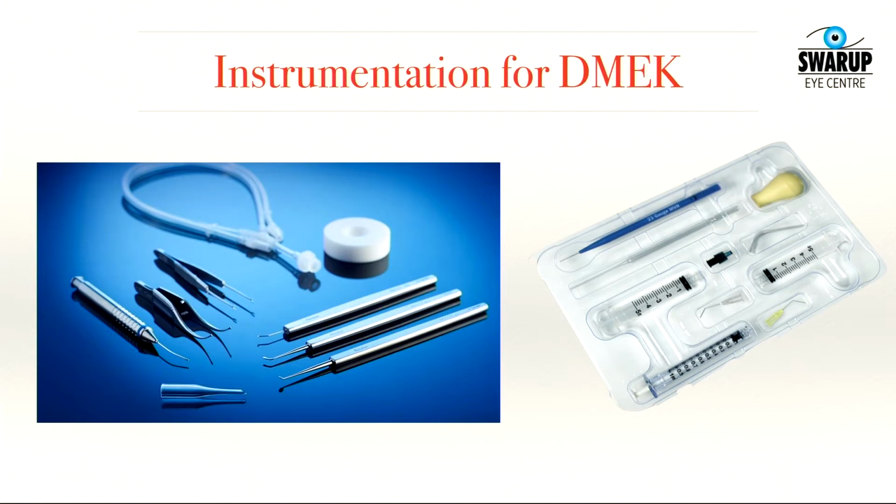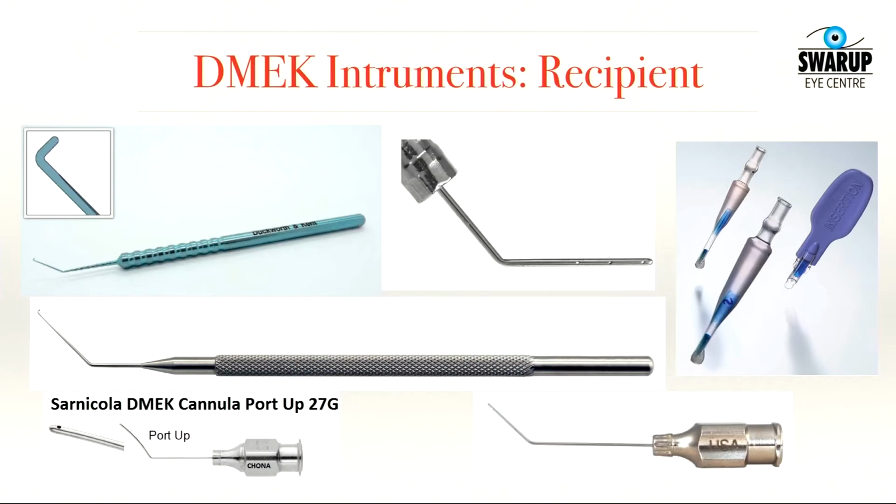Unlike other lamellar procedures, for DMEK you do need some specific instruments which make the surgery much more predictable and easier. You have ready-made sets that are available from some companies like Geuder and DORC, and even some Indian companies have got very cheap sets that are available. You have specific instruments for the recipient for all steps, right from stripping of the Descemet's membrane to insertion of the scroll into the eye, to cannulas for opening up the scroll, to cannulas for inflating the anterior chamber with both balanced salt solution and air.